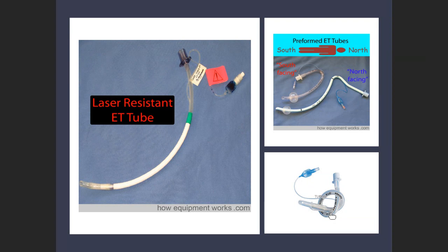When would we need to ensure that the airway is good and we're not going to get a kink? Really, any surgery that is being done in odd positions. So when we put the patient prone, face down, they're operating on the back or the neck. If we're going to put the patient in a sitting position, as they do for some neurosurgery in some centers. If we have a tumor that's pushing the airway, we want to put in the largest tube we can get in, but that we know won't kink.